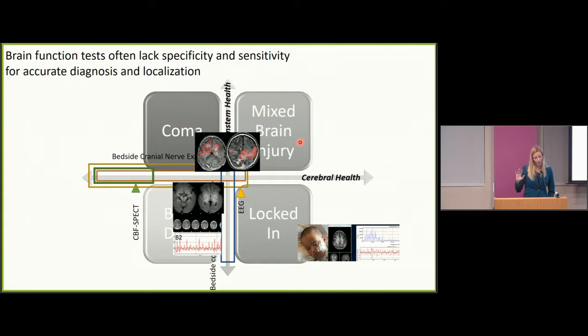So this is a summary of the cases that I reviewed here. We have many other cases. I can't really go over all of them in this time period, but you can see that in general, this neonate progressed to brain death, this child in whom we thought originally may or may not recover from coma, and this child who was thought to be in unrecoverable condition did recover, and these we were able to tell by resting state functional MRI and by no other test.